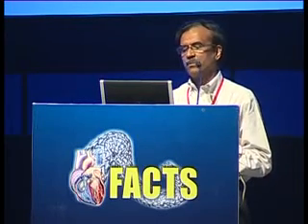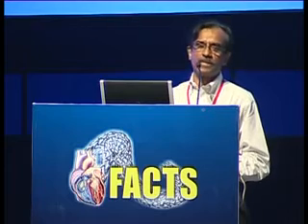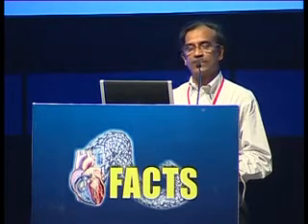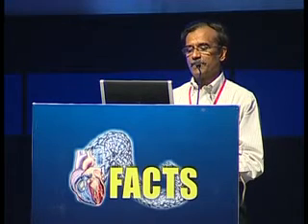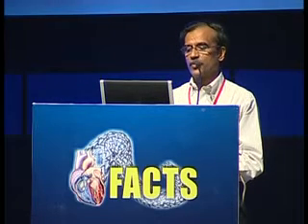If this maneuver fails, you have to redilate with the 14 French dilator, and even if that doesn't work, you may need to dilate the interatrial septum with a balloon. Typically, a PTCA balloon can be used.